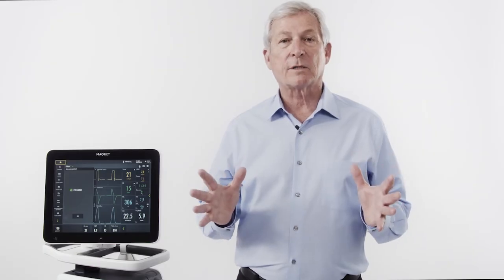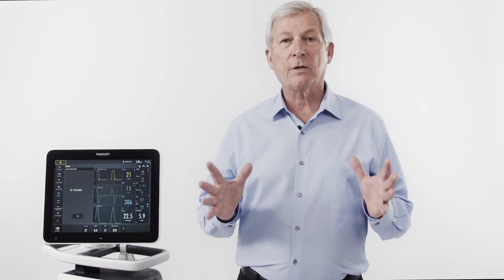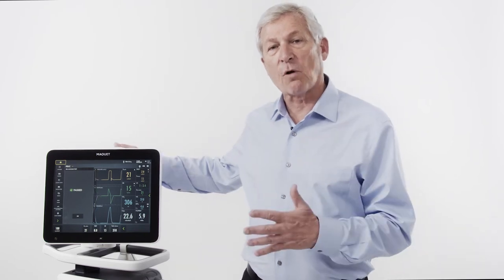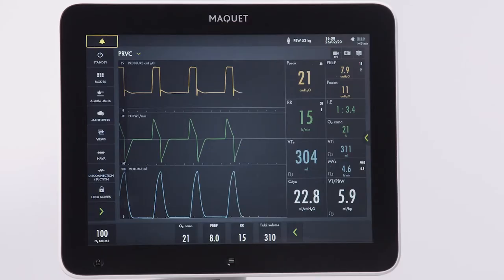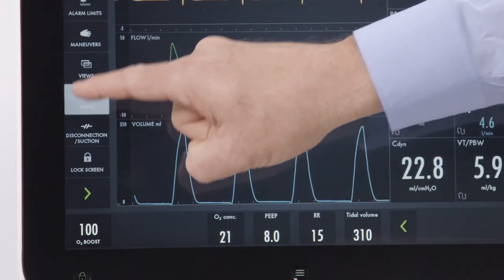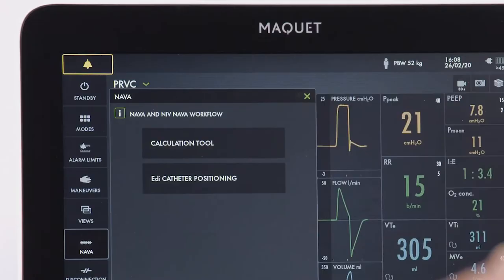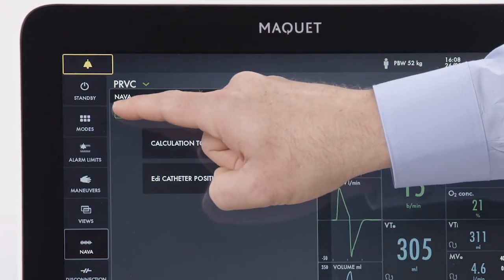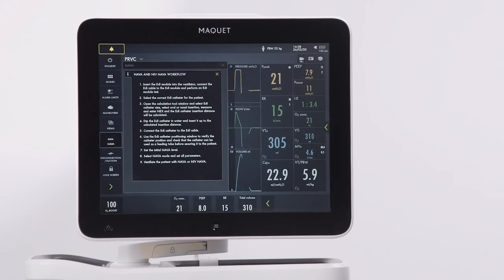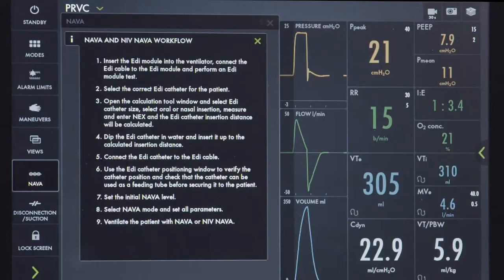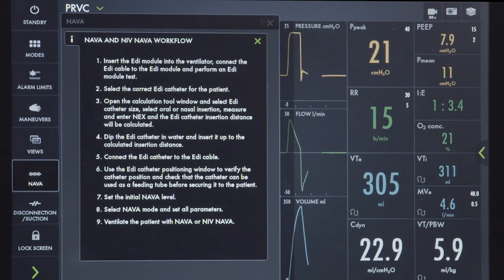We're going to use a recorded simulator to demonstrate the position of the EDI catheter on the Servo-U ventilator. From the main screen on the servo ventilator, select the NAVA quick view. The NAVA quick view will take you to the workflow screen. Throughout NAVA settings, there is contextual help and informational text to guide you when needed.